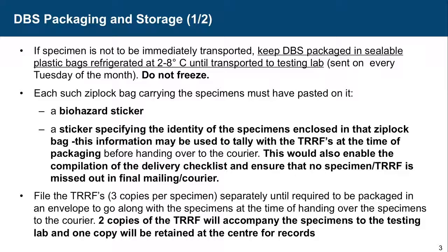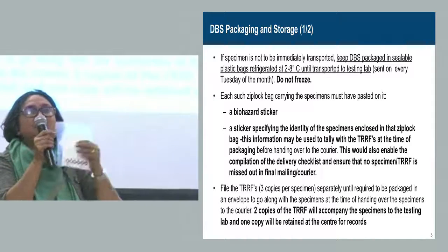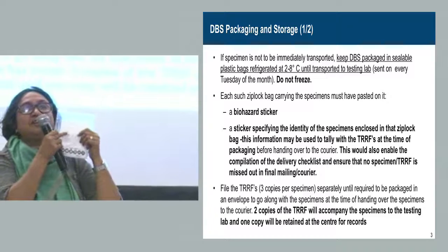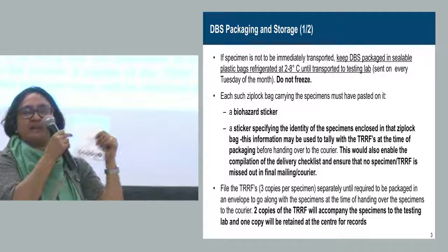Do not freeze — that is very important. Each Ziploc bag carrying the specimens must have a biohazard sticker pasted on it, because many people open that refrigerator and they should know what sample is inside. They should have a biohazard sticker. And there should be label stickers on which the unique infant code of each card is written.